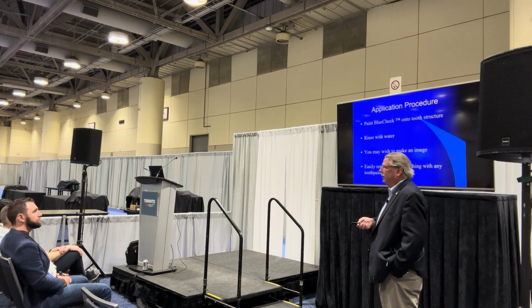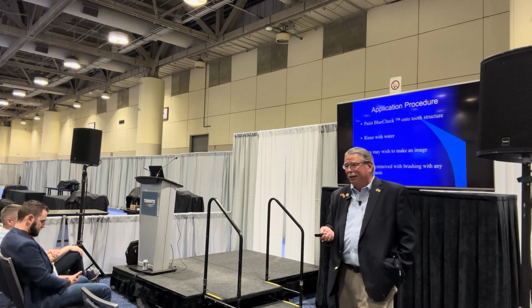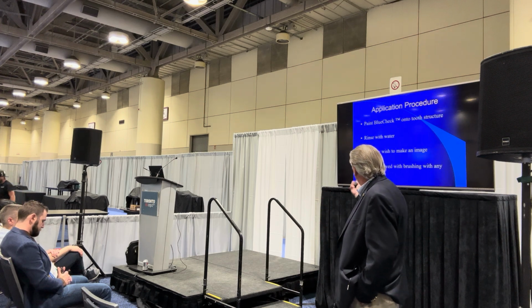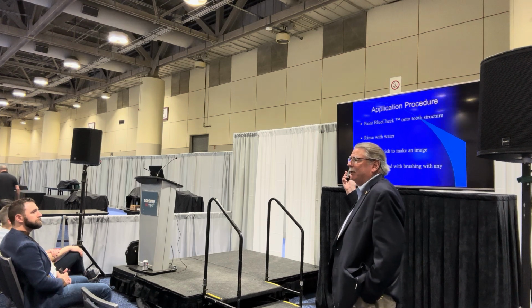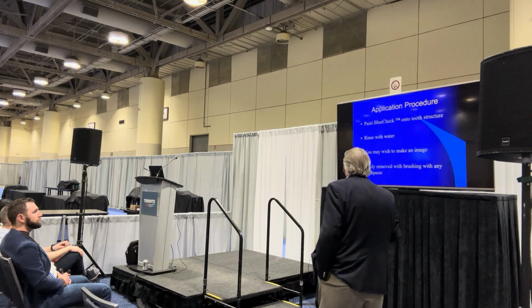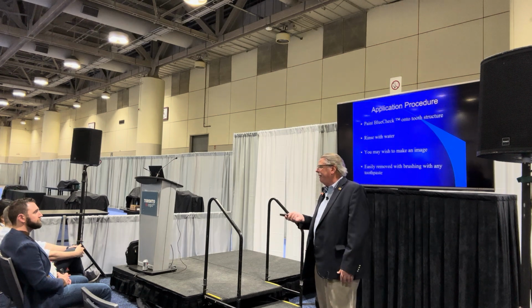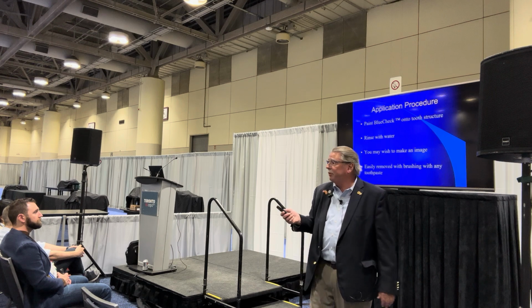So what do you do? Kind of simple. I hate to waste your time here, but you paint it on. Rinse with a little bit of water. I would recommend taking images, but you don't have to unless, obviously you're going to do it if it's blue, but if it's not, you don't have to. And that way you have a baseline. And then you brush the kids' teeth or have them brush their own teeth, and just normal toothpaste takes it right back off. So real simple.